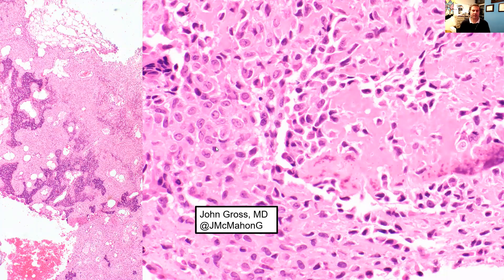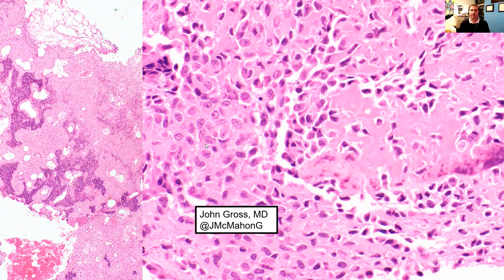The final variant is chondroblastoma-like osteosarcoma. On the far left you see the mineralized osteoid pattern with an otherwise fairly pink, variably epithelioid tumor. On the far right, this collagen matrix has mineralization and is variably mitotically active. It resembles chondroblastoma, with some cells that are even reniform and kidney bean-shaped. This is a very rare osteosarcoma subtype and is certainly more aggressive than a chondroblastoma.